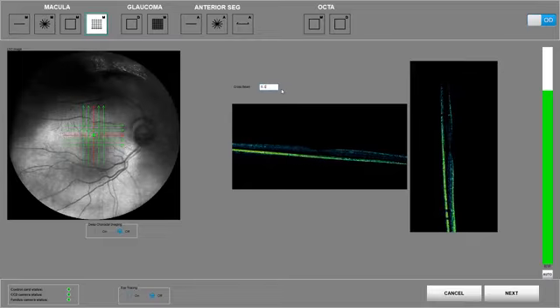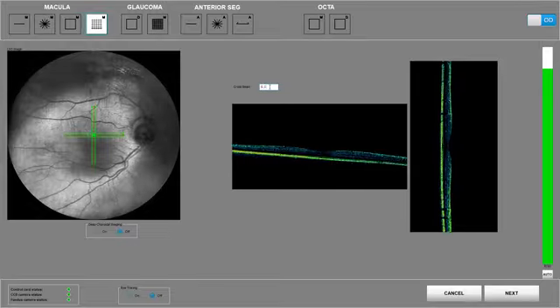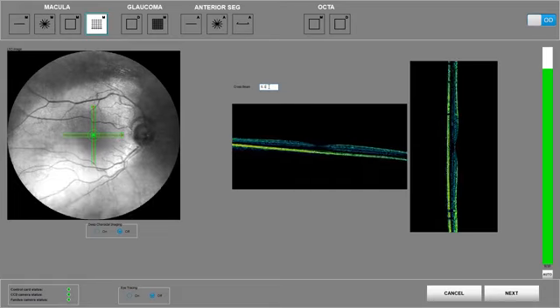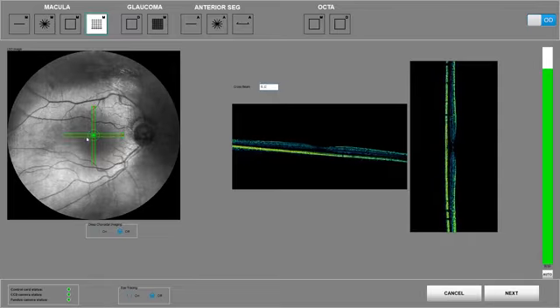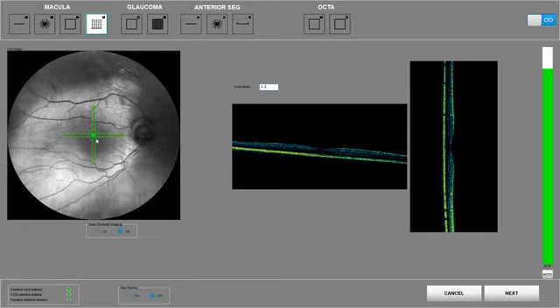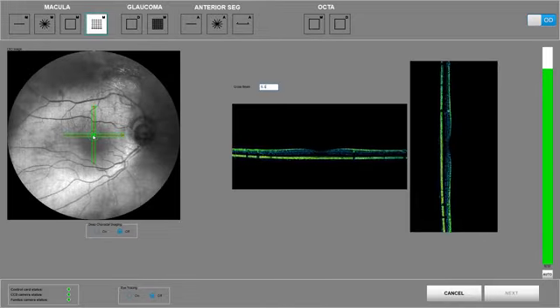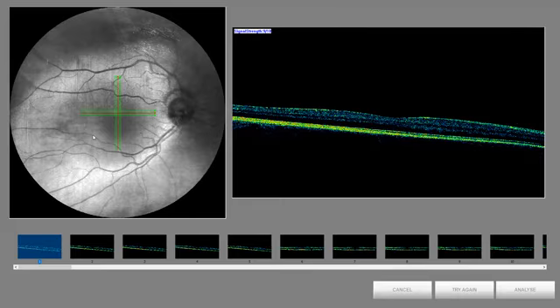to 10 microns, as you see here, and by using this feature, you can go from 1 micron to 200 microns. Again, you have to have the focus appropriate, and once you have a very good quality image, you press the joystick button. The OCT will acquire the images. It will acquire 100 images, as you can see here, and again, you press the Analyze button in order to have the best image.